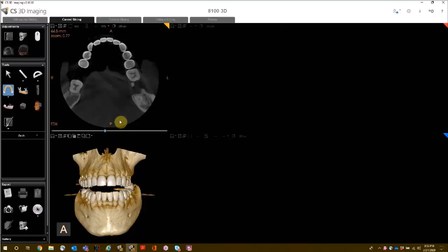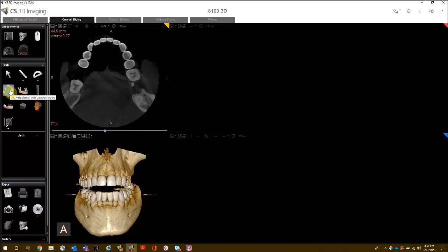This can be done on either the maxillary or the mandibular arch. Once your arch is in view, on the left side of your screen, activate the dental arch creation mode under the Tools section. Note: a drop-down arrow gives an option to have the software auto-create an arch. In the NPR preferences, you can choose to have the software automatically create an arch every time.